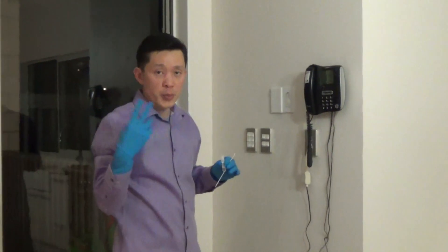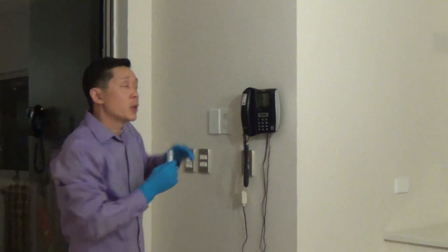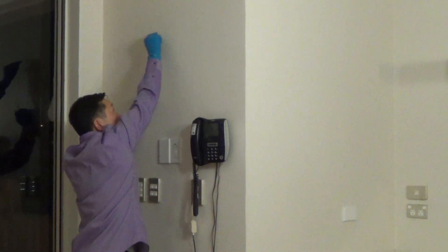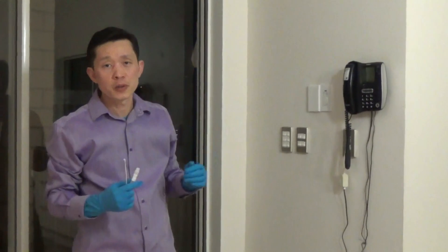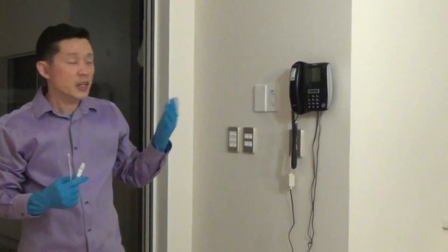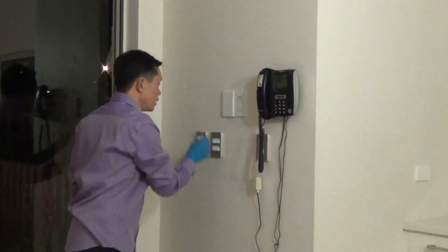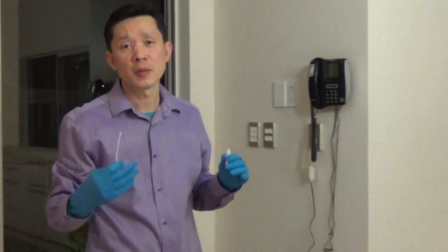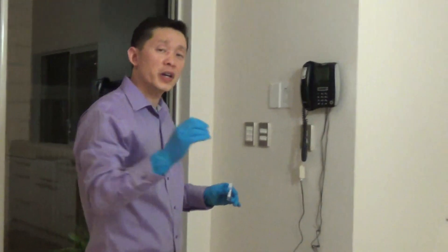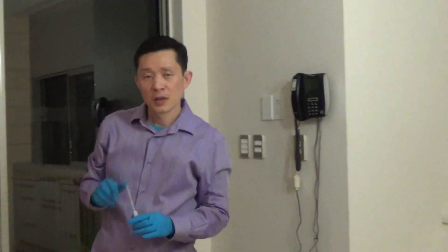Two things you need to remember. When you're doing the first initial screening, remember: above shoulder height first. The reason I say above shoulder height is because you might have a cousin or a neighbor with a meth addiction. They can come here and touch all the high-traffic areas in the lower area. If you swab that area, it's going to come up positive, but that is a false positive. That's why above shoulder height is quite important for your first screening test.